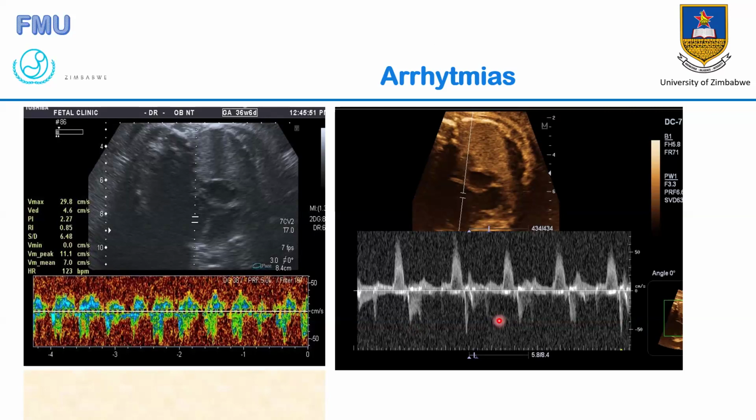Which I overemphasize on the normal heart rhythm. What else is wrong? What else is wrong on the heartbeat? Please, let's have a try from other people, not just from one person.